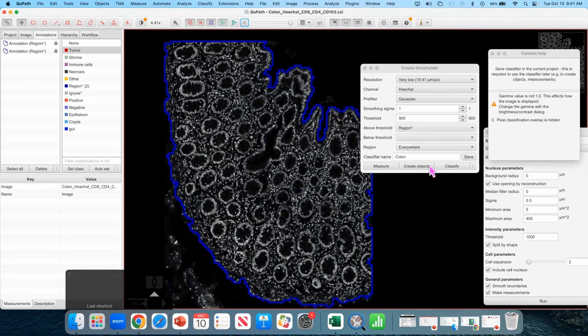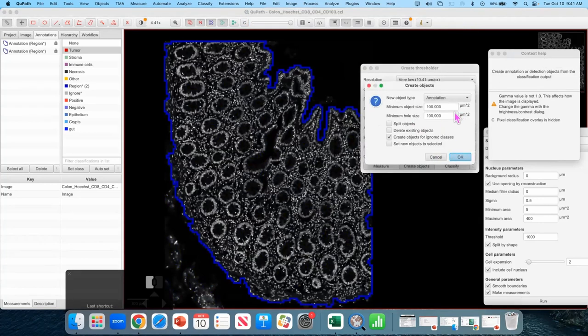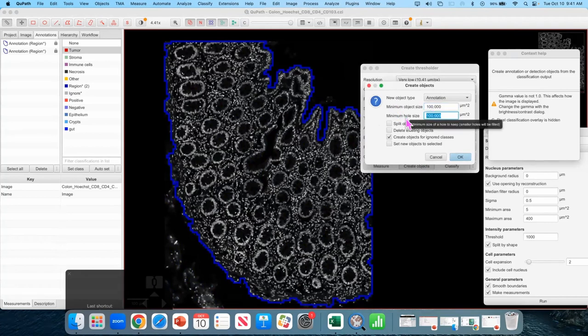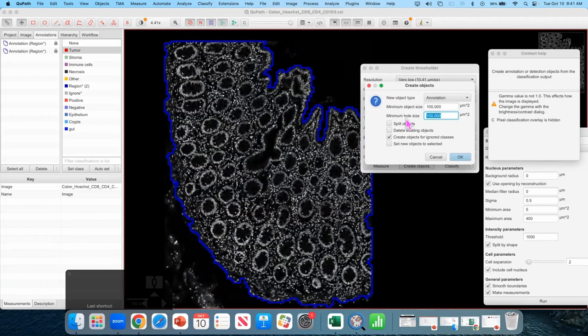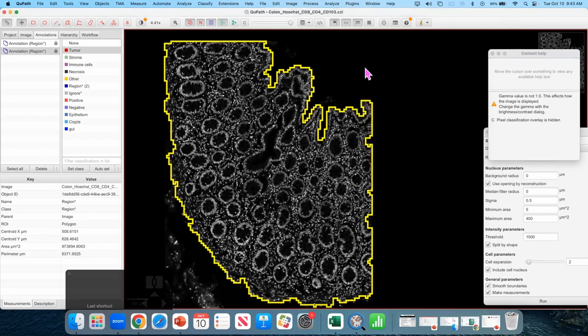And the difference between what's blue right now and what's blue right here and like the outline is going to be the subject of Pete's presentation later. At least a little bit. So if we do want to remove the lumens. Yes. So what do we do? You would make the minimum hole size smaller. I'd still recommend going bigger than zero. But like make it smaller than whatever is the smallest lumen you wanted. So if like a lumen needs to be 500 microns squared to count otherwise it's just a weird gap, put this at like 400. We're good. We have cells. No. We have tissues.